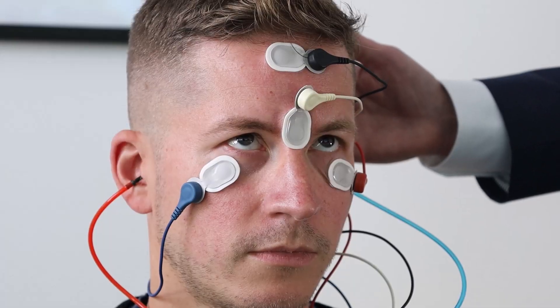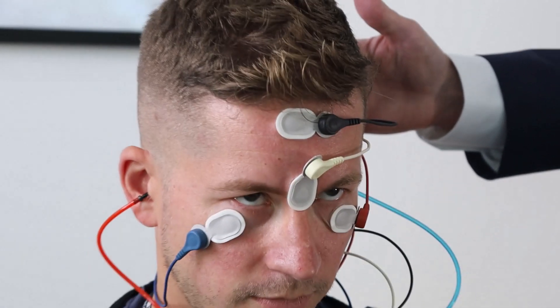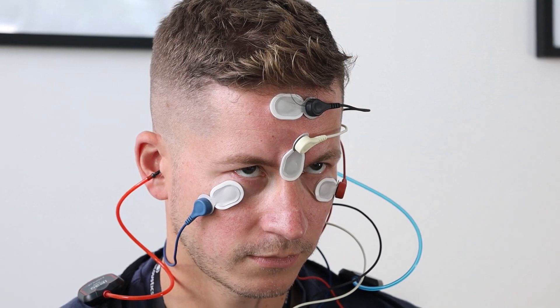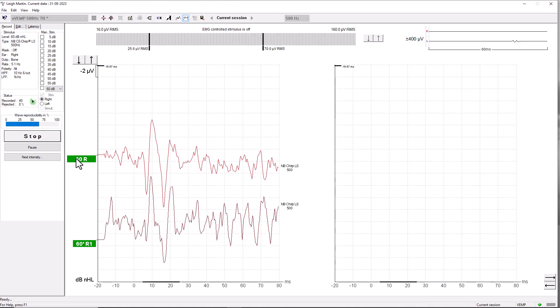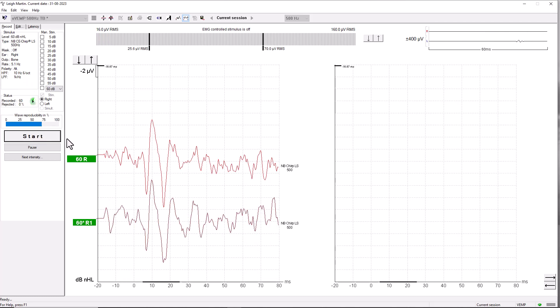We've got one recording in position. I'm now going to demonstrate the technique of asking Lee to bring his head forward, raising his gaze up to the top. I'm going to record again at the same stimulus level. I'm going to deliberately demonstrate a short run, such as you might have in a patient that's fatiguing. We're at 40 responses, 60 — and I'm going to stop that.